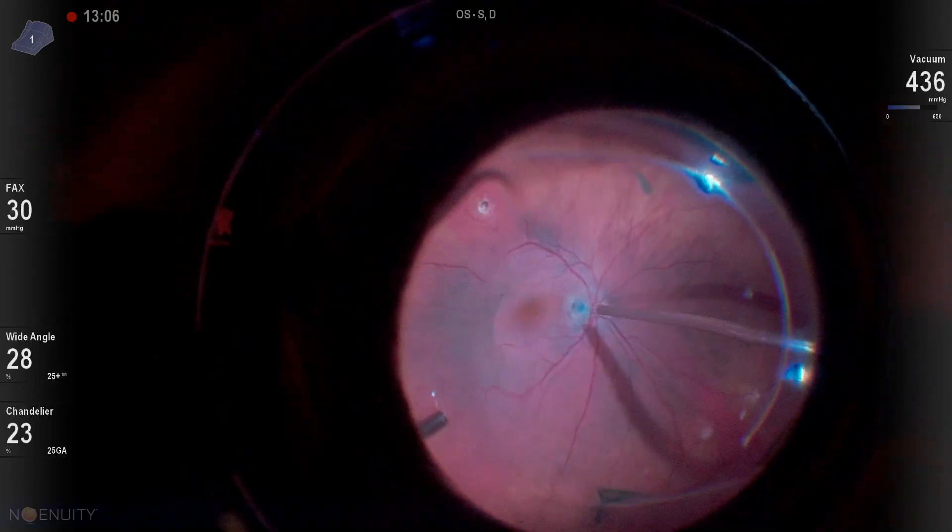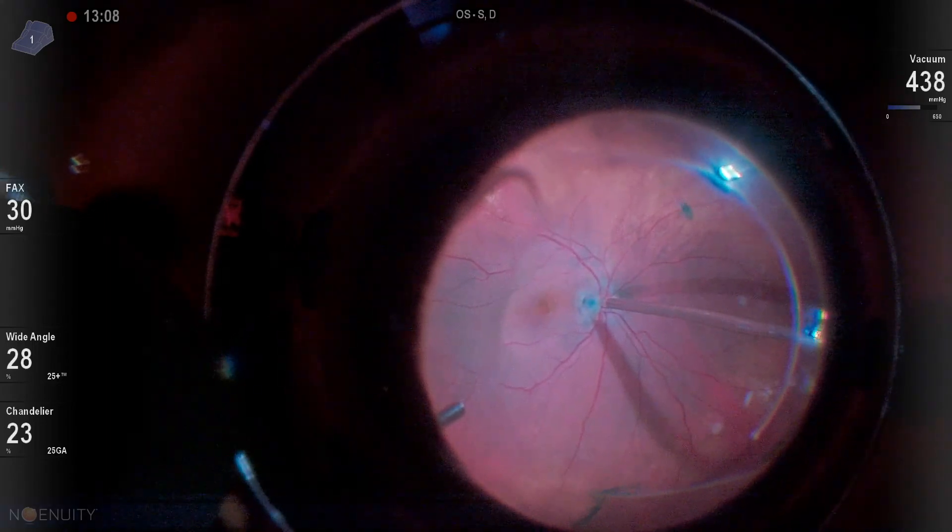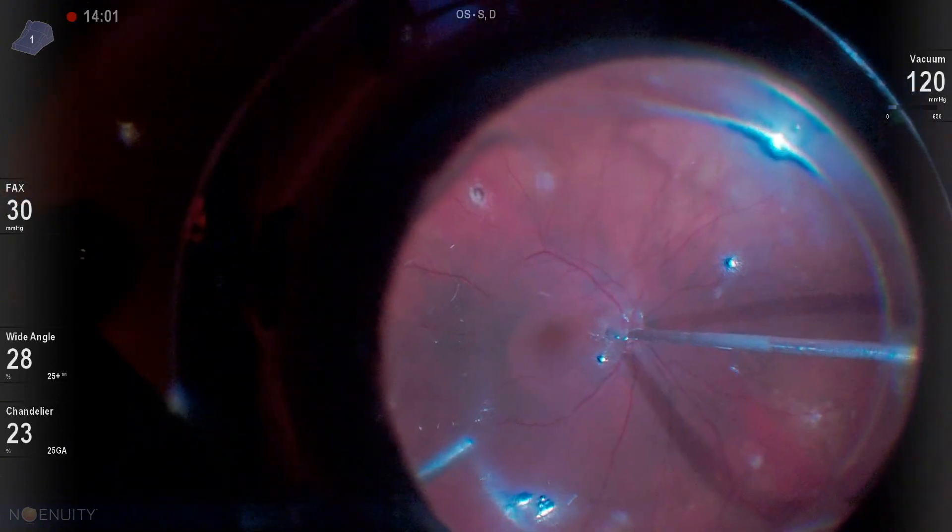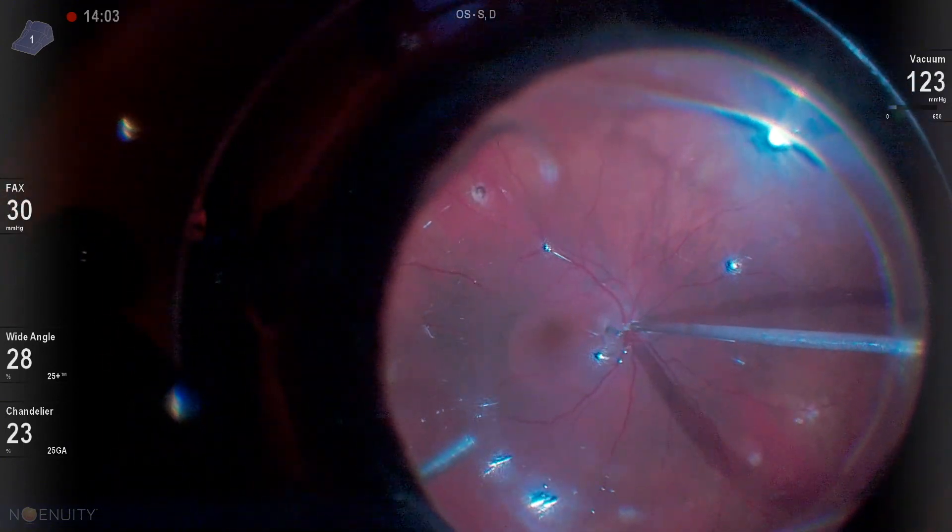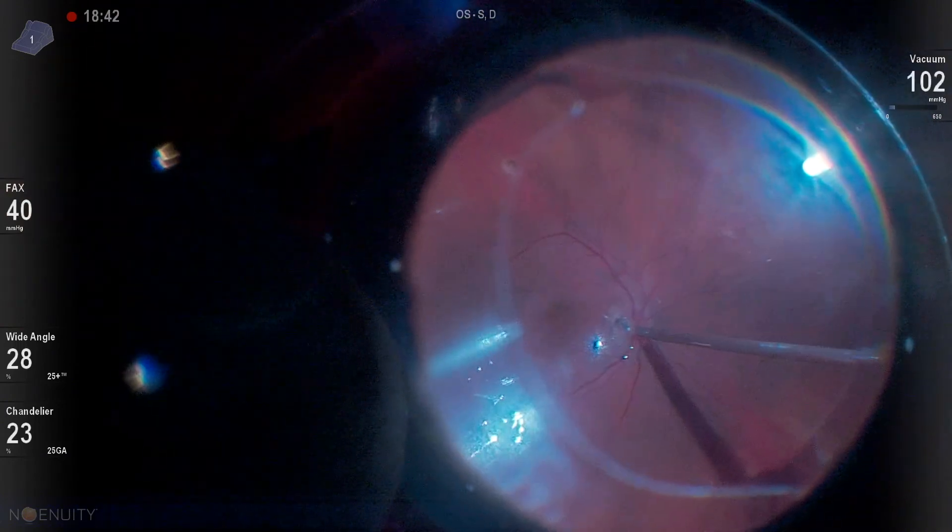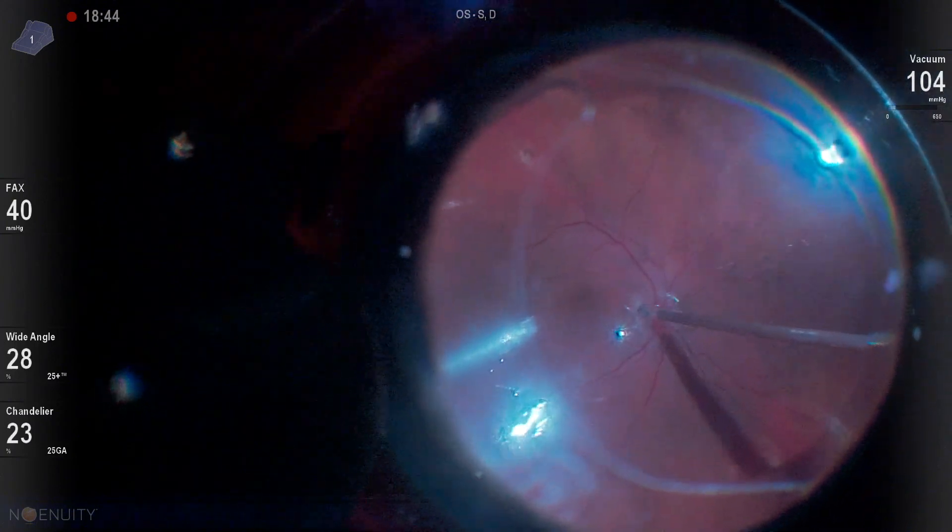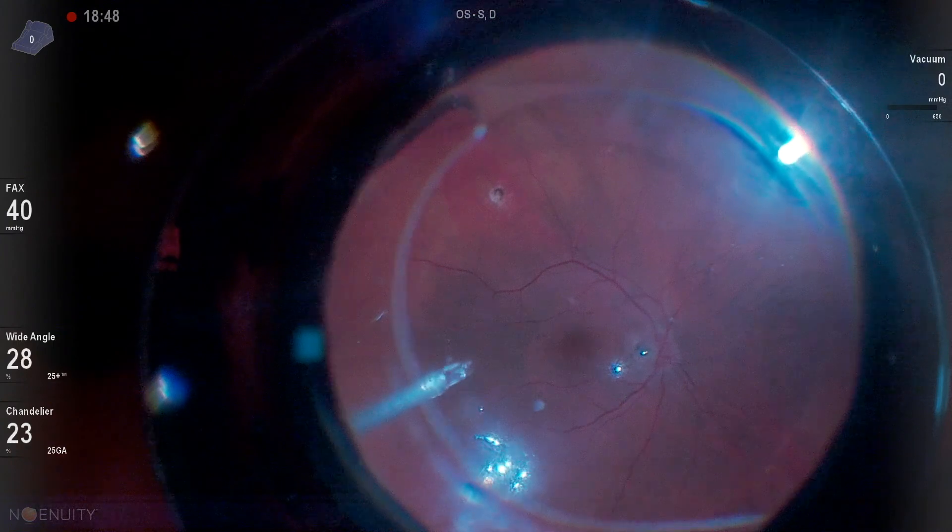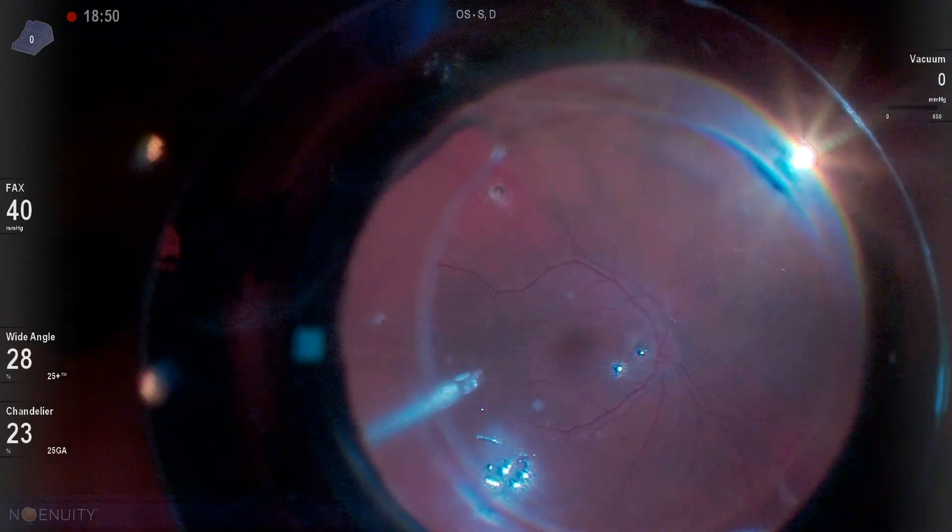The real key to using this tissue glue is the fact that there's an activator and there's the glue itself. And so you really want to have this as dry as possible. Now, this is where the chandelier light comes in really helpful because in reality, what you have to do is you have to have two instruments in the eye. So in my left hand right now, I actually have the activator. In my right hand, I have a soft tip.